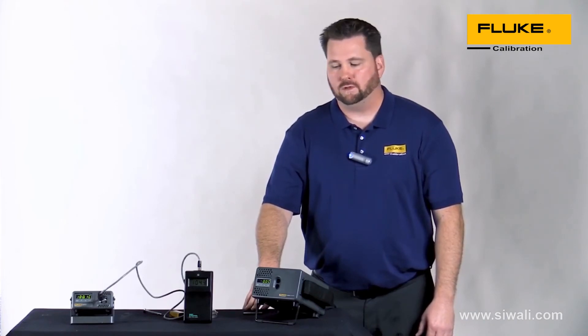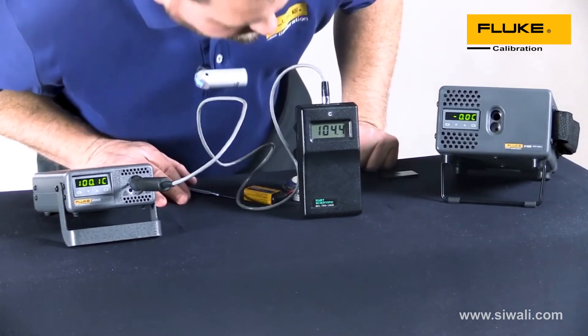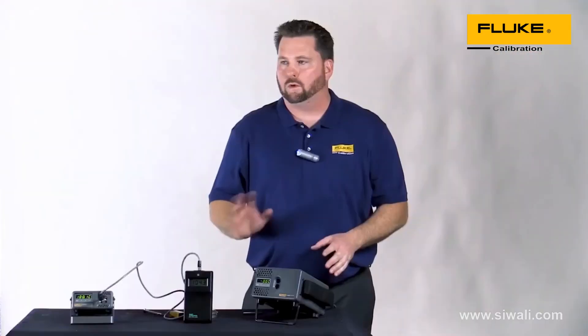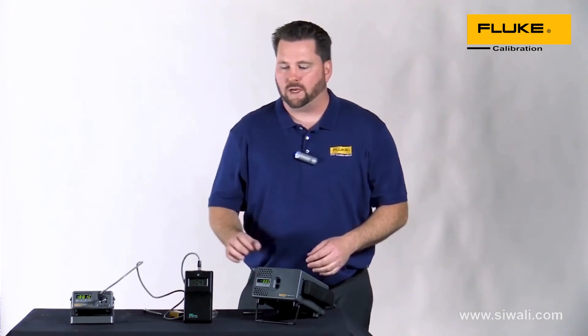Let's make another adjustment to the thermometer and see what our results are. I've moved right over into the hundred-degree point — that's kind of where we left off — and you can see here that from the boiling water to the dry well we're almost four degrees and some change high.